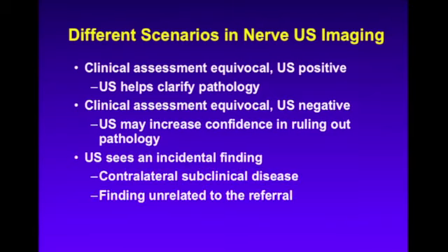The next scenario, which is actually fairly common, is that ultrasound sees an incidental finding. It may see contralateral disease that is not yet presented clinically, or it may find a finding completely unrelated to why the patient was referred.